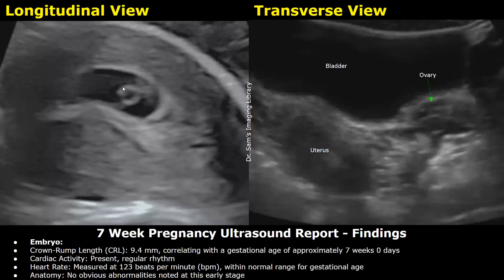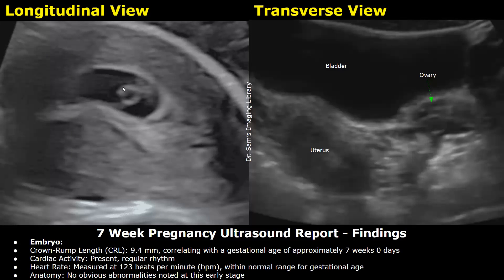After that, you can write the findings of the embryo. Crown-rump length was 9.4 mm, correlating with a gestational age of approximately 7 weeks, 0 days. Cardiac activity: present, regular rhythm. Heart rate measured at 123 beats per minute, within normal range for gestational age. Anatomy: no obvious abnormalities noted at this early stage.